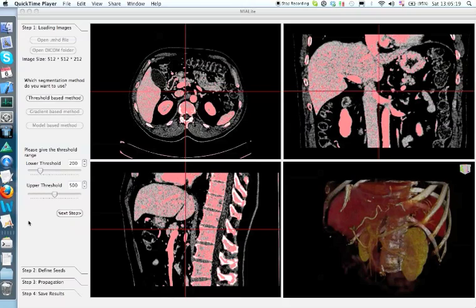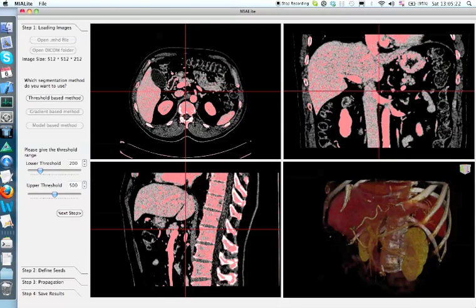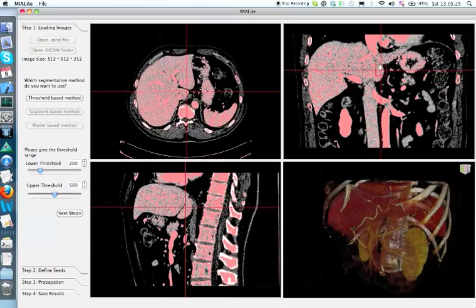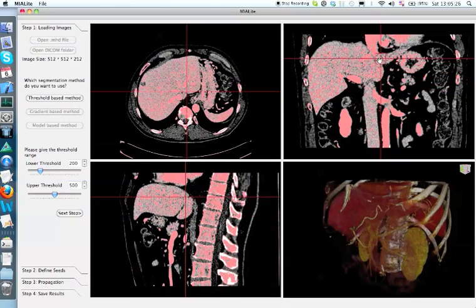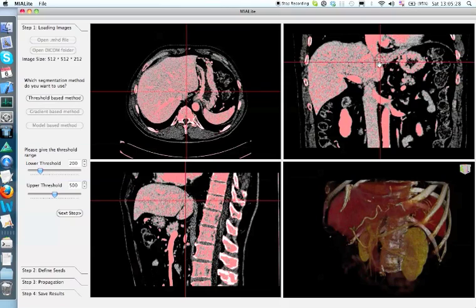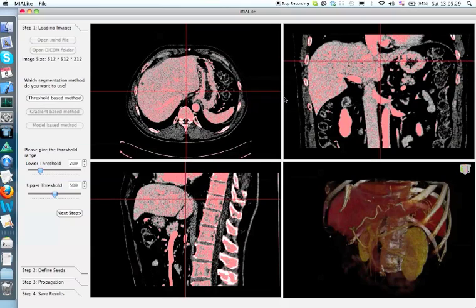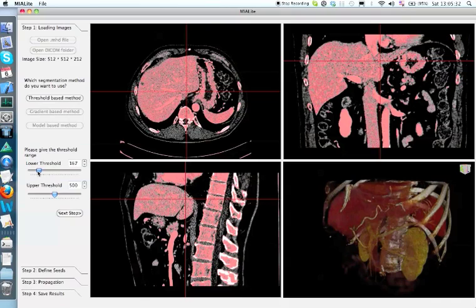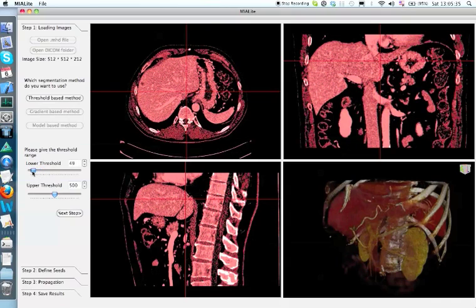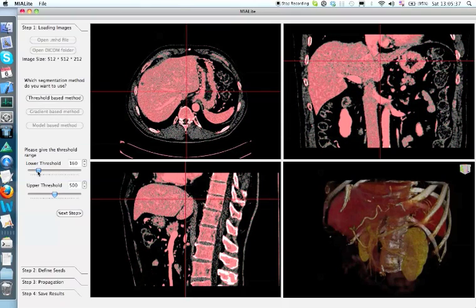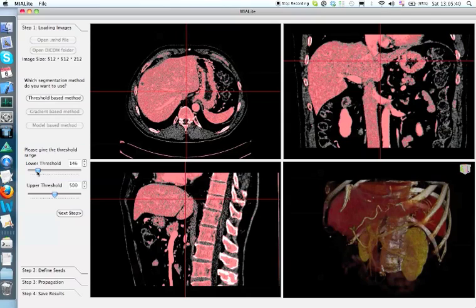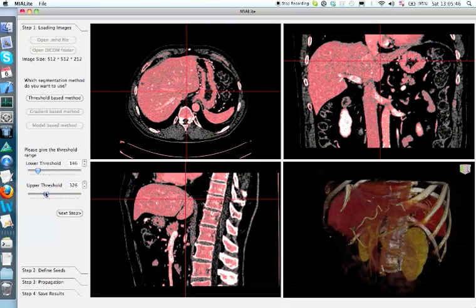It is very difficult to segment the liver from CT data. First of all, it is difficult to find an optimal threshold range to separate the liver from surrounding structures. When I set threshold, I am not expecting to cover every pixel of the liver, but rather to generate a dense red cloud on top of the liver area.